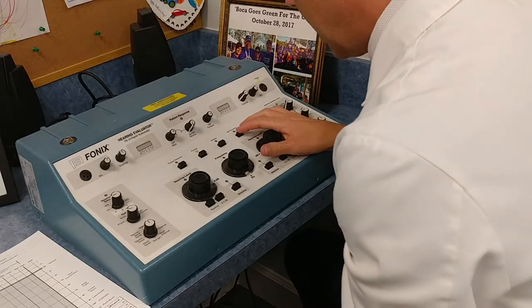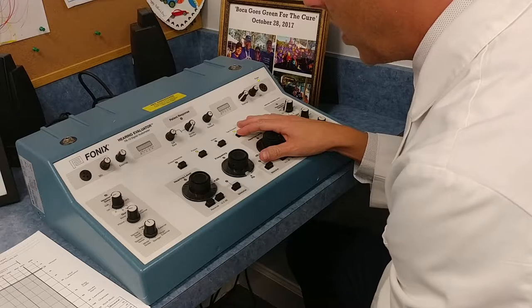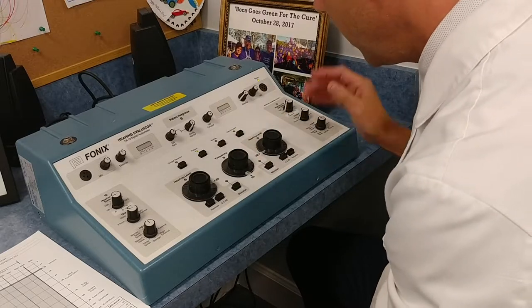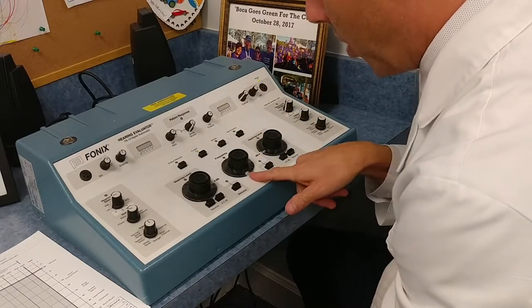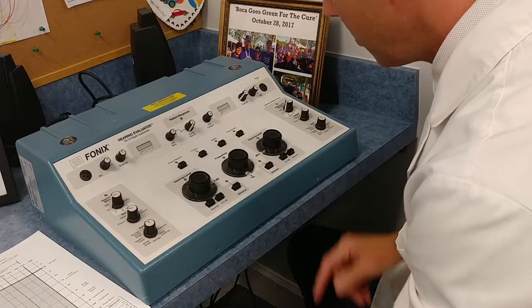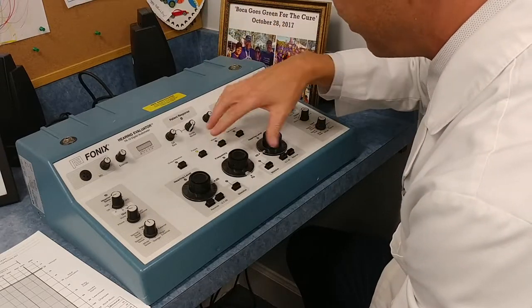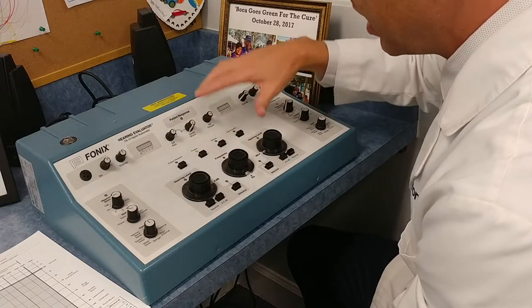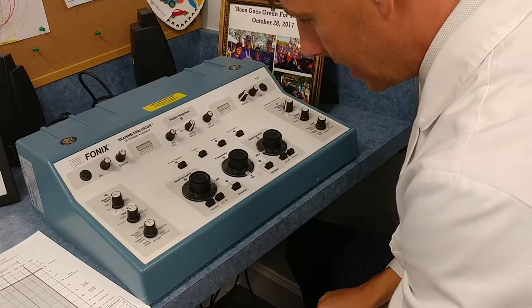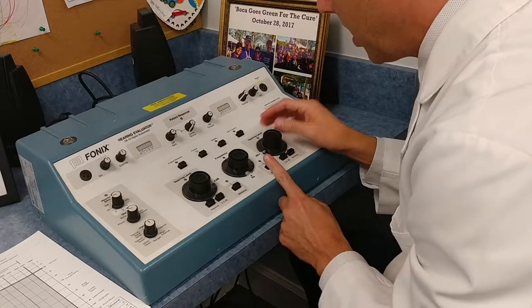I'm going to let the patient know to say yes every time they hear the tone, and because I'm going to try to catch it as quietly as possible, even if they think they hear it I want them to say yes — I can always double-check my work. I'm going to start at 1,000 Hz no matter what, and I'm going to start at 40 decibels. I'm going to utilize pulse, not warble. Warble can deviate off the chosen frequency; pulse is more of a pure tone, and because it's pulsed it will constantly remind the patient that they are receiving a stimulus.